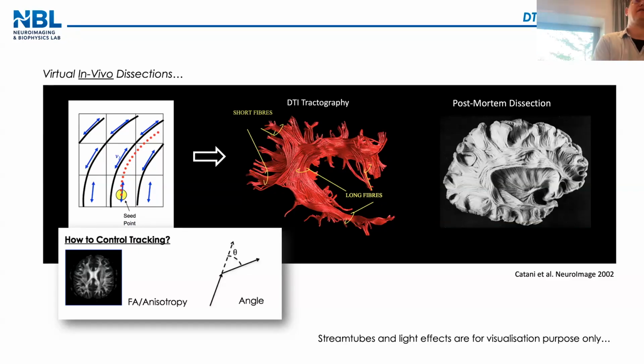The same thing is tractography. Tractography is a macroscopic representation of what's going on. So you have a lot of axons in the same voxel, a lot of changes. So we know an average is going in that direction, but maybe the average might be distorting the real anatomy. So the correct mathematical reconstruction is not the correct anatomy, okay? This is important to realize. So you need to know your anatomy, you need to validate things. Over time, we started to be confident with some tracks, but some tracks cannot be trusted just blindly, okay?